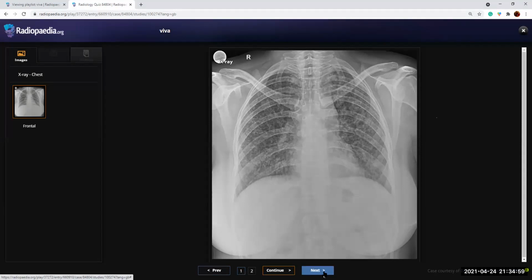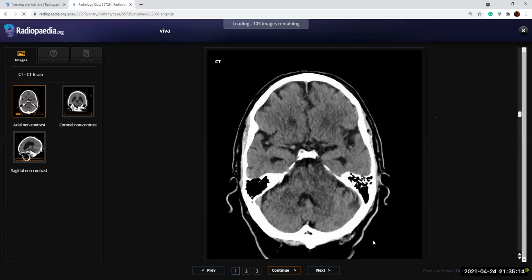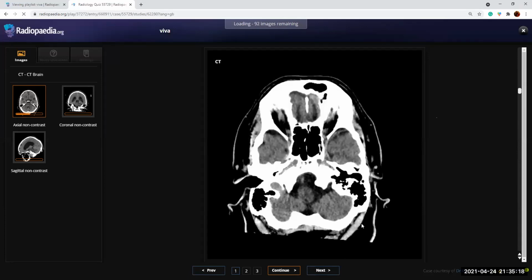So, Sabahat, what happens next? Who comes in? Thanks. Okay, Sabahat, do you want me to keep the timer or will you? I was wondering if you can. Okay, thank you. So it's 12.5, right? Yeah. Sabahat, this is a case of a patient with dizziness. Let me ask for control. You can ask for control. Approved.